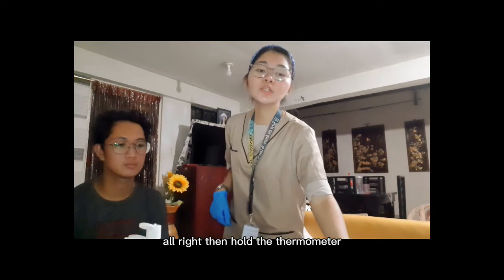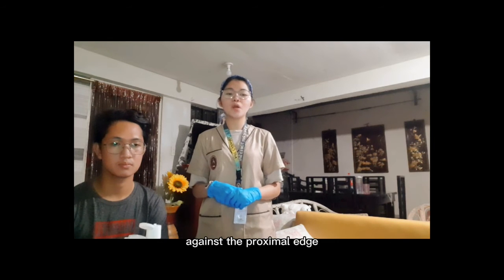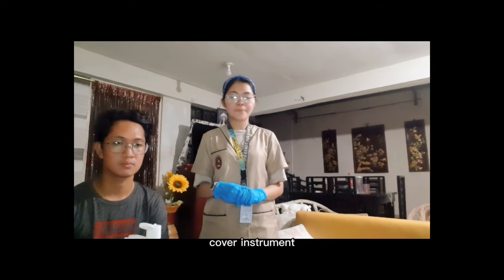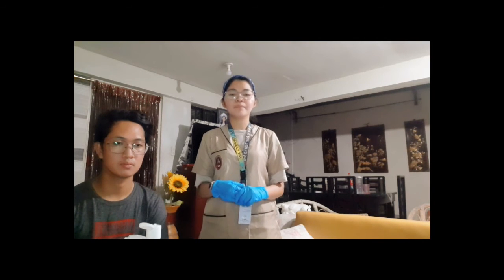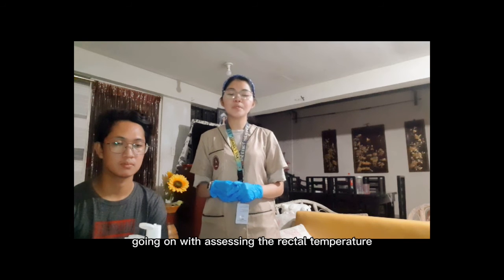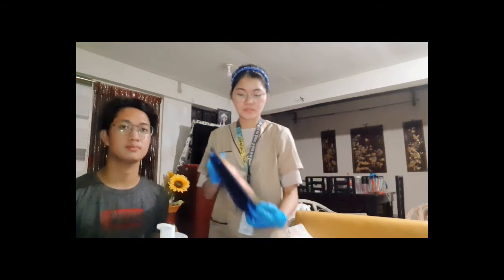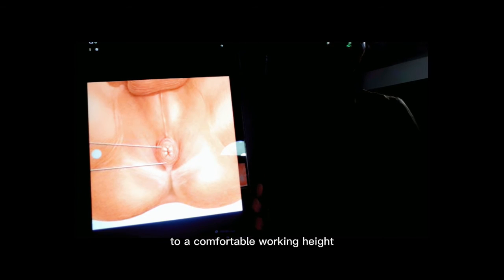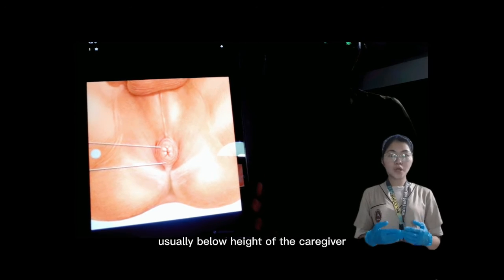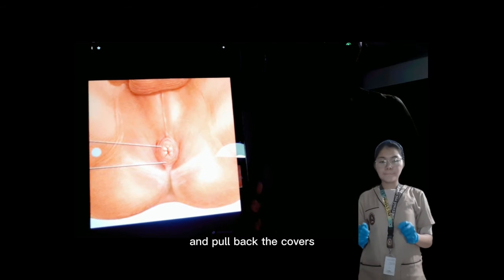Alright. Then hold the thermometer over a waste receptacle and then gently push the probe cover with your thumb against the proximal edge to dispose of probe cover. Instrument will automatically turn off in 30 seconds or press and release the power button. Going on with assessing the rectal temperature. Assuming that this is my patient, first we have to adjust the bed to a comfortable working height, usually below height of the caregiver. Then we have to assist the patient to a side-lying position and pull back the covers enough to expose only the buttocks.